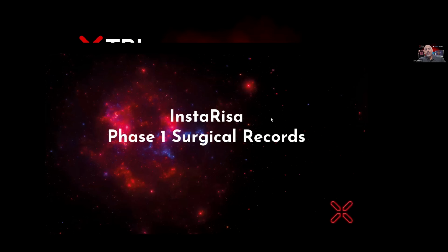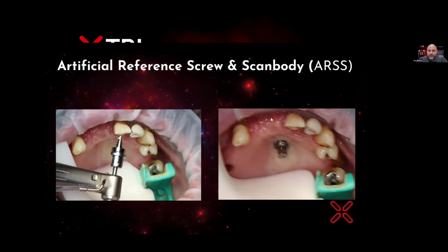So once they approve it, let's go on to surgery. This is the InstaRisa artificial reference screw and scan body system. It's a fiducial marker. The idea is, how do I get from point A to point B surgically and make sure that I can deliver that smile? First we initiate the osteotomy in the upper arch with a lance drill. You want to drill about 3 to 5 millimeters first, and then insert the artificial reference screw until you get about 35 Newton centimeters.